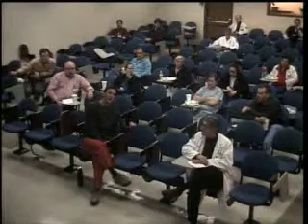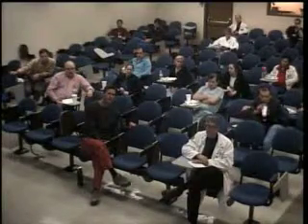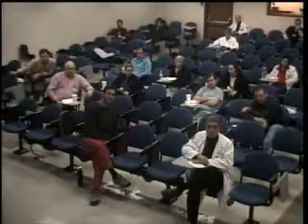Okay. Hugo, so MRI will not change management, right? No. We do get an MRI. If the patient has a stroke and then we get a CTA that is clean, then we recommend an MRI just to see if it's a lacunar stroke, small stroke, distal stroke. But that can be done later on.